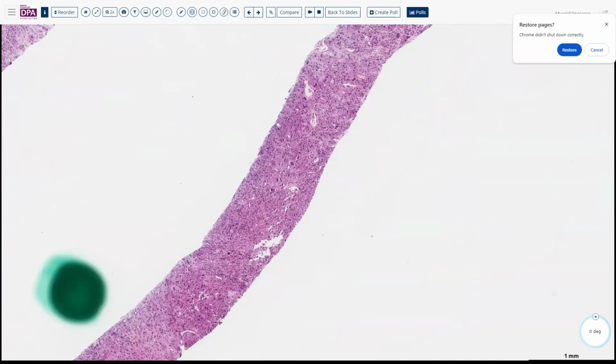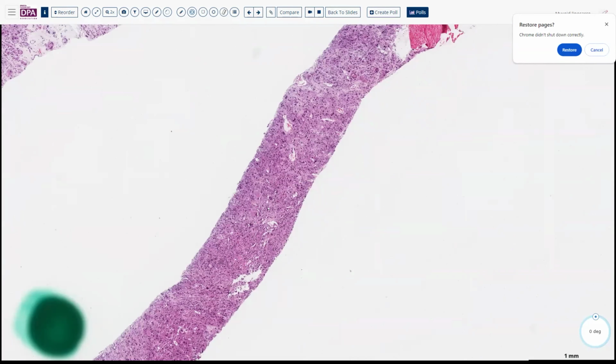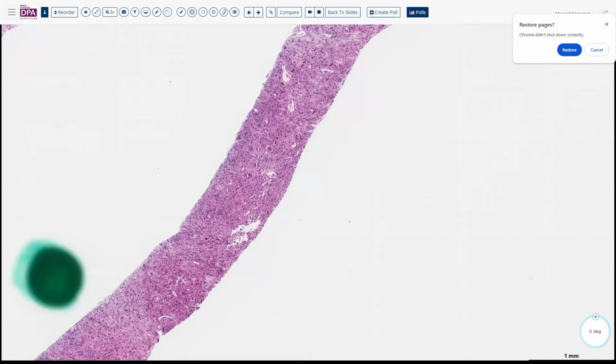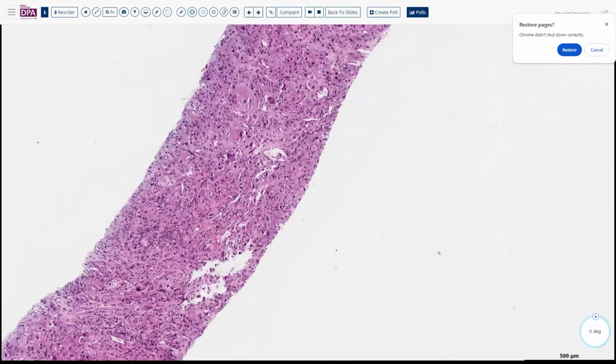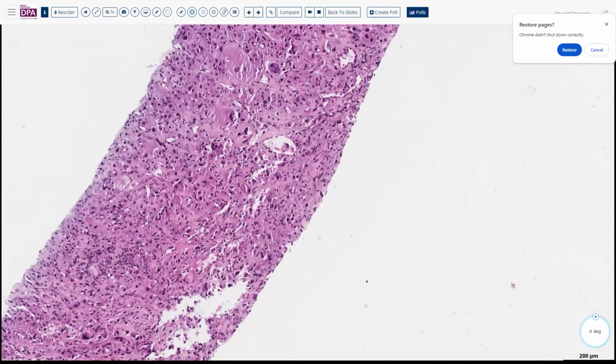So approaching a very high-grade pleomorphic tumor like this can be very daunting. And thank goodness today we have a variety of tools to use. So this was approached first with immunohistochemistry. And things we thought about would be undifferentiated carcinomas, hepatocellular carcinoma, maybe melanoma, certainly very pleomorphic for that even.